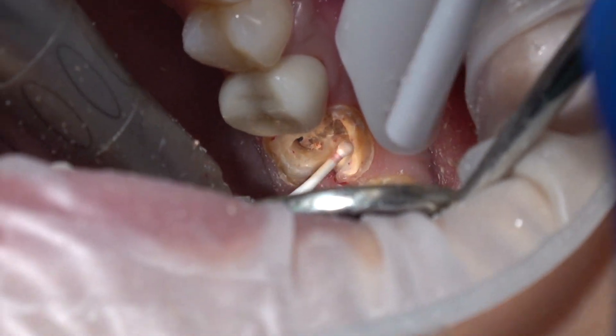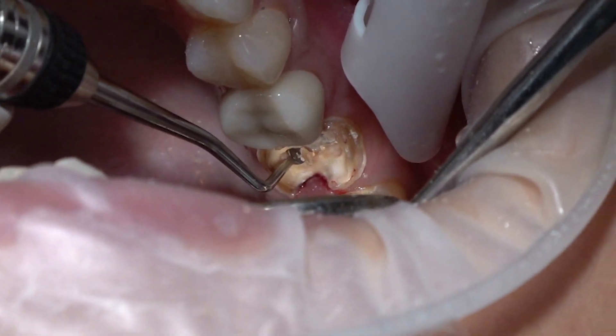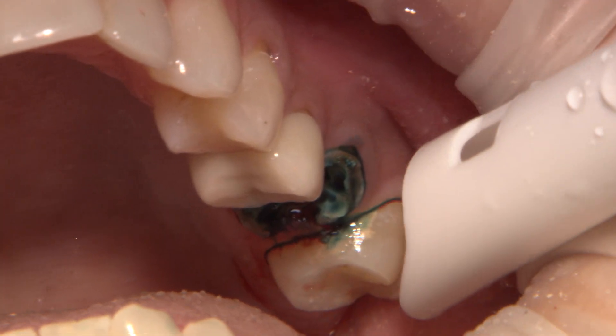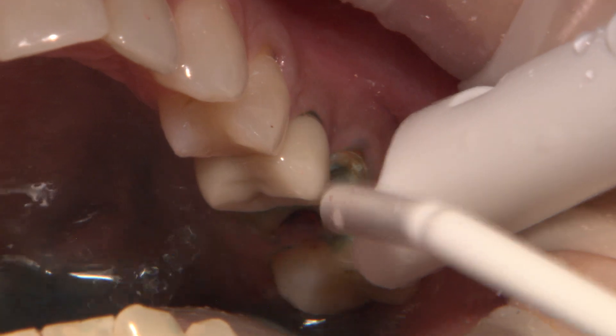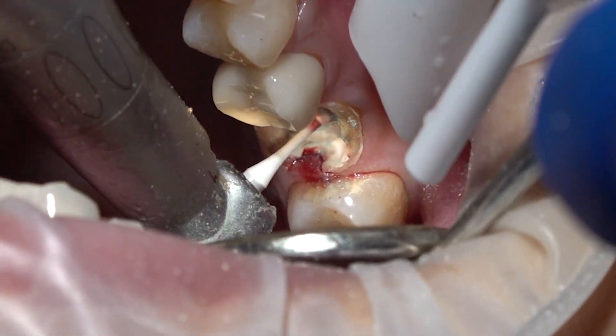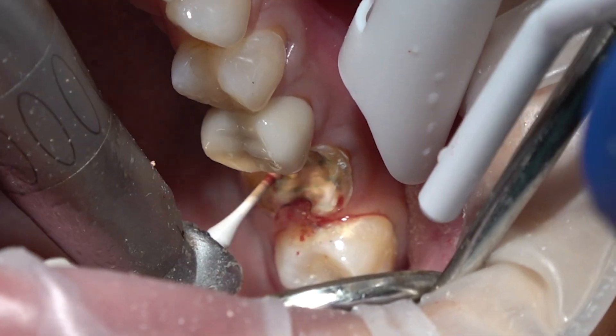For tooth number 14, this is a situation with extensive caries, causing the patient's crown to fall off. Caries control is done with a slow-speed round burr, spoon excavator, using Exposé Caries Detector. If I can find a margin, I can restore it.